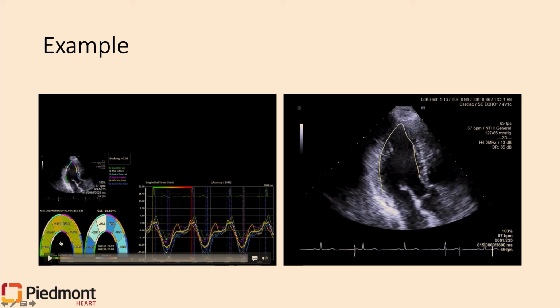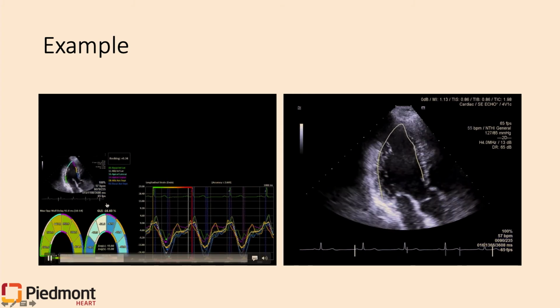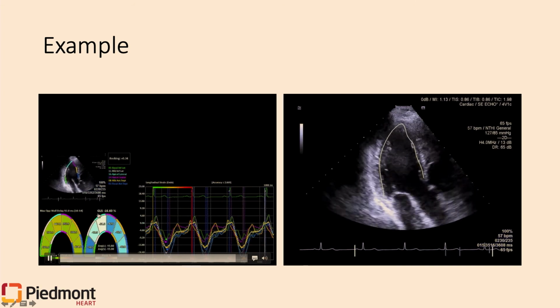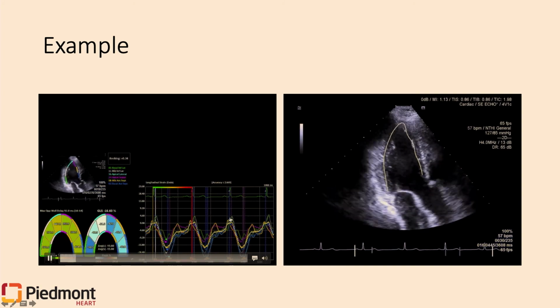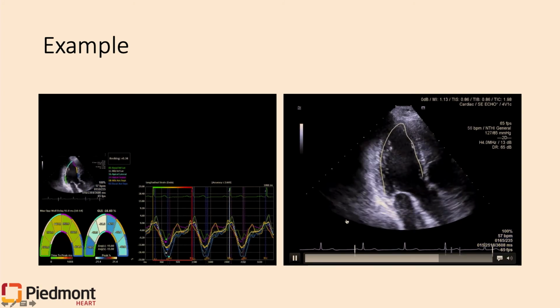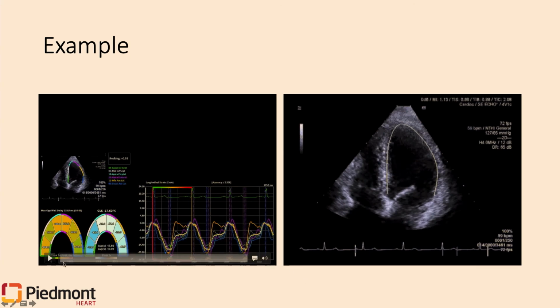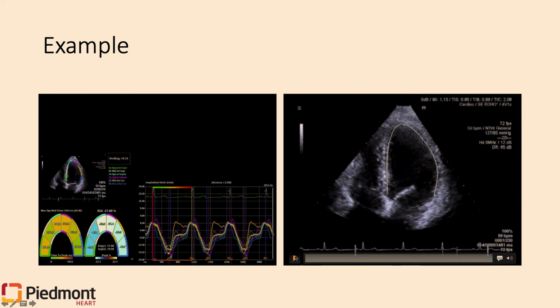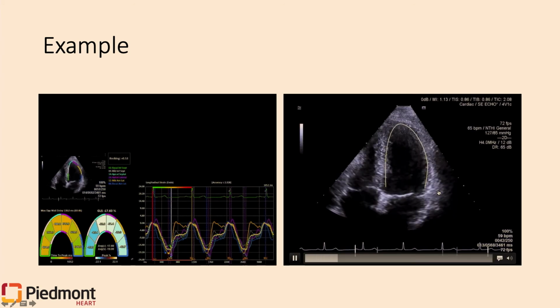This should be repeated again, and these images acquired for the 3-chamber view. And once again, the strain in our platform is written here. You can use the strain curves again. Make sure you agree with the tracking. Look for any regional deformation. And finally, again, in the 4-chamber view, same thing: strain curves, strain value, and endocardial border tracking.